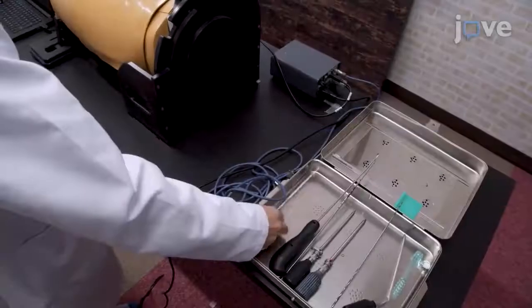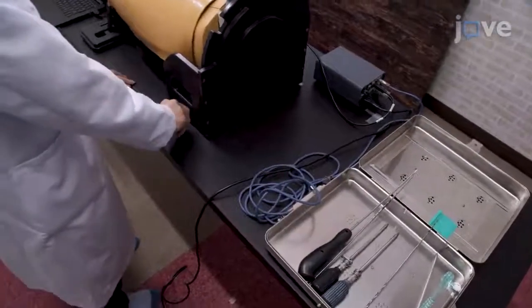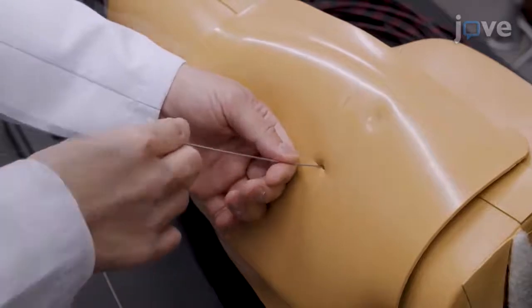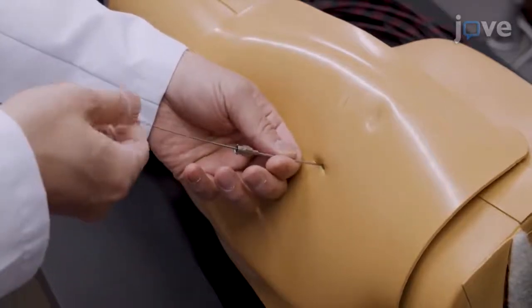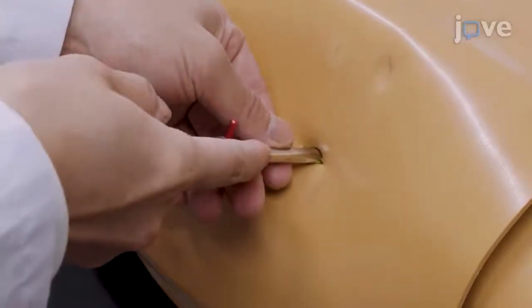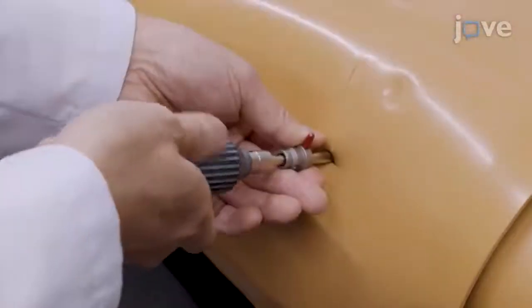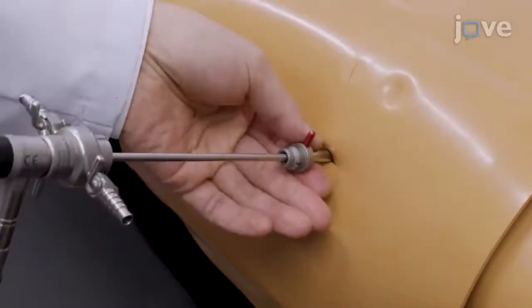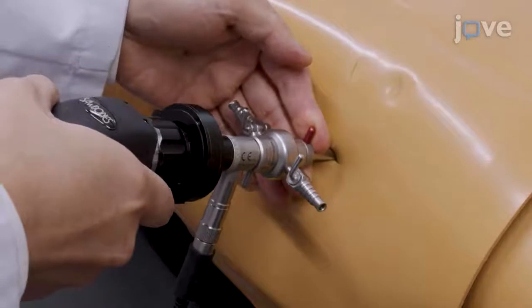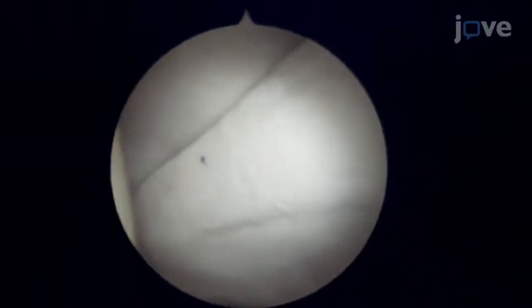To generate the first portal, insert a cannulated needle and guide wire into the hip joint from the tip of the greater trochanter to make a normal anterolateral portal. Insert a 5.5 mm cannula with an obturator along the guide wire. Then remove the obturator and insert the 70-degree arthroscope and camera along the cannula. Then confirm that the capsular triangle between the labrum and femoral head can be observed in the view from this portal.